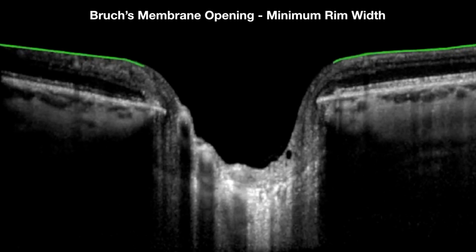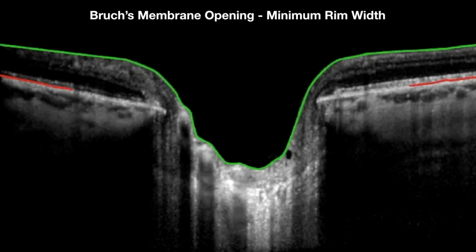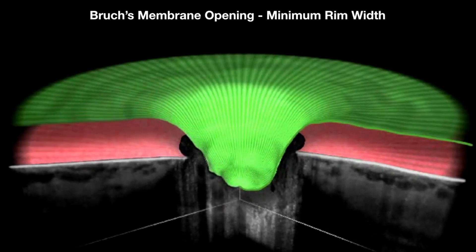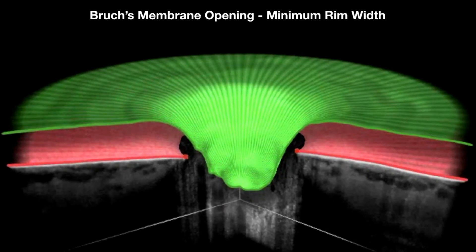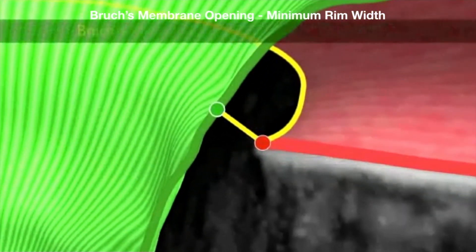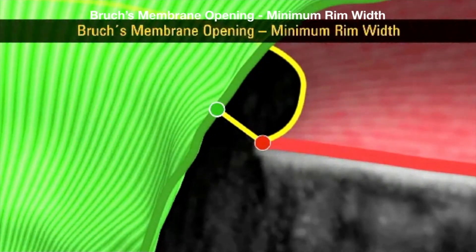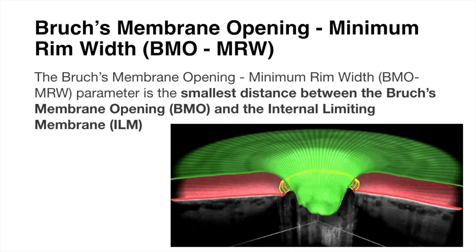A 3D animation of Bruch's membrane opening minimum rim width: once the internal limiting membrane, Bruch's membrane, and Bruch's membrane opening are segmented, this 3D angle beautifully reveals the Bruch's membrane opening minimum rim width. BMO minimum rim width is the smallest distance between the Bruch's membrane opening and the internal limiting membrane.